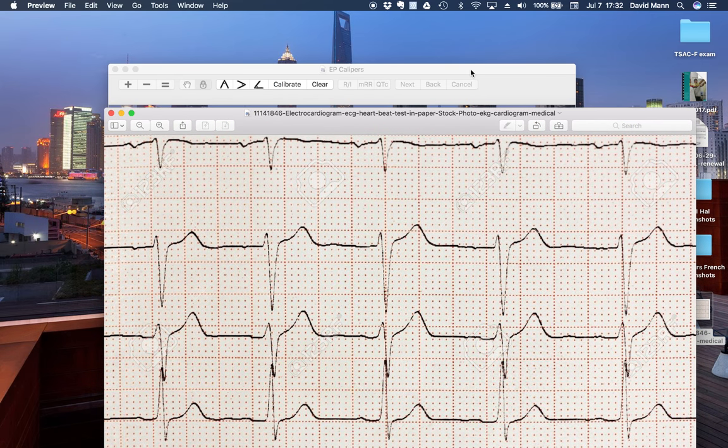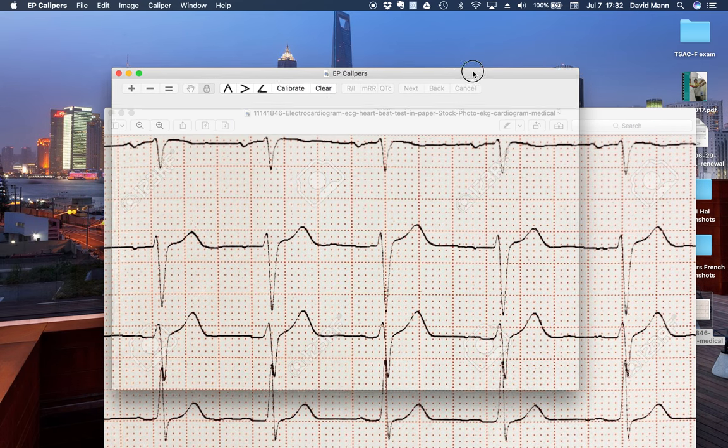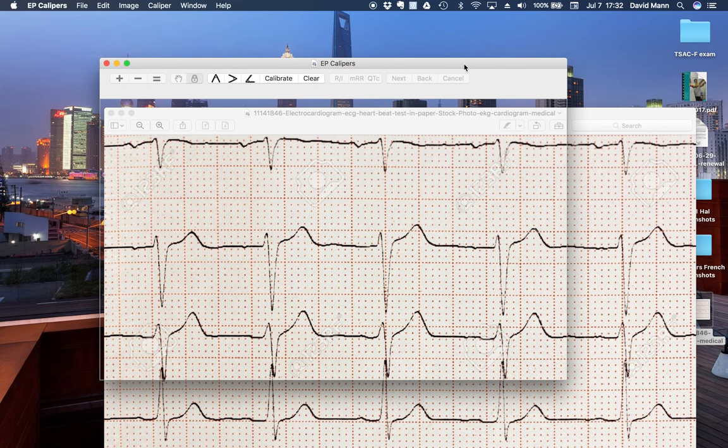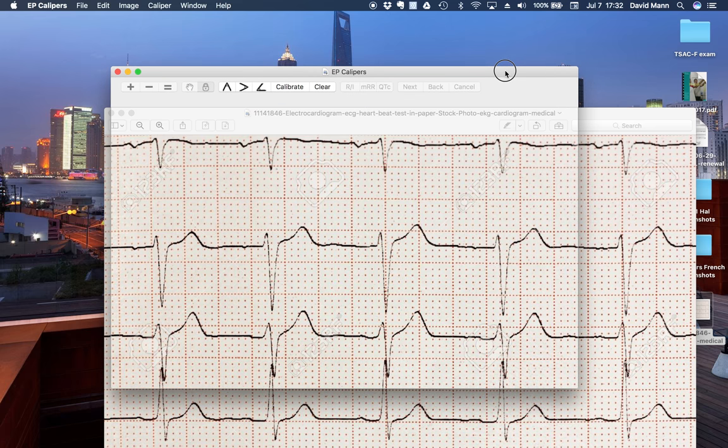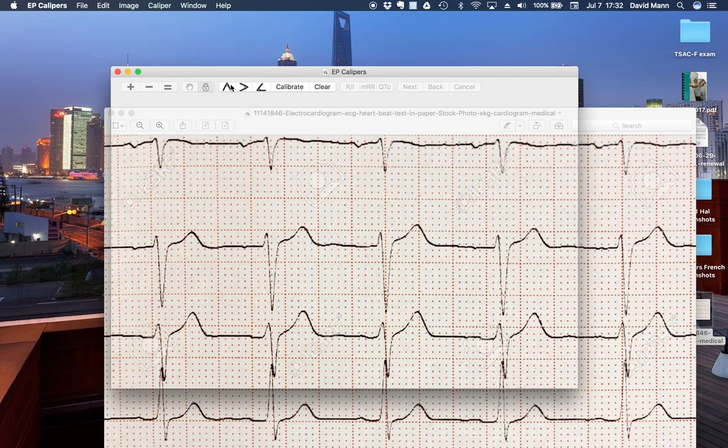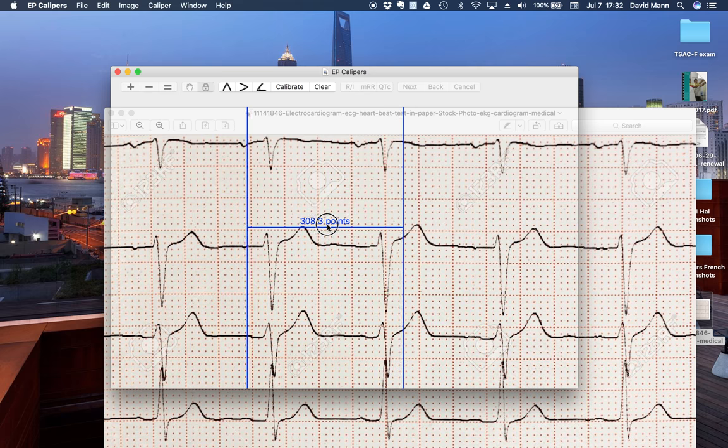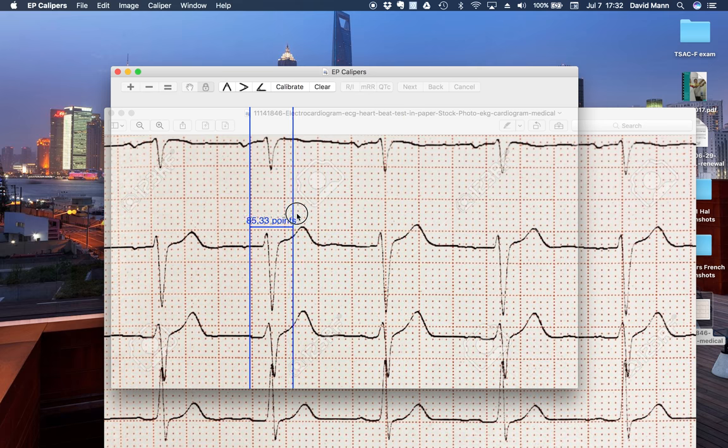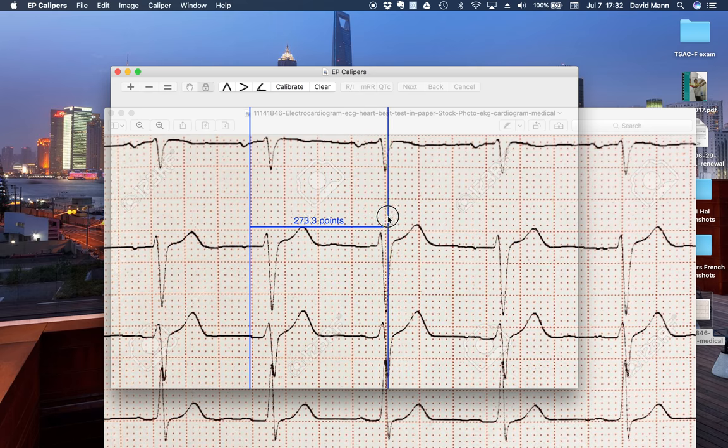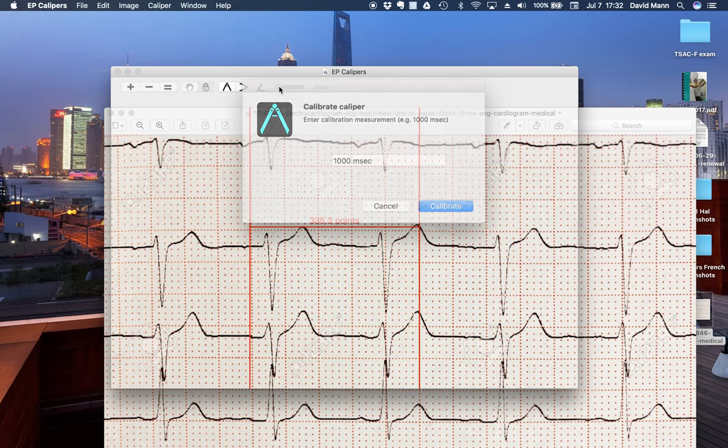And I can put EP calipers on top of it and put some calipers on and do the same kinds of measurements. 1, 2, 3, 4, 6, 8, 10. Calibrate again.